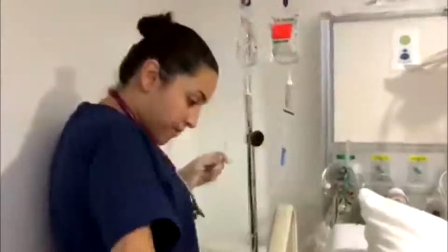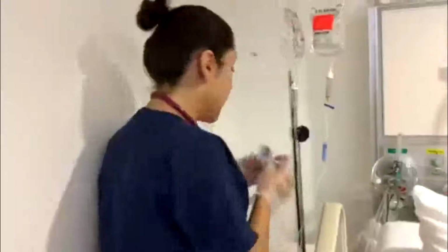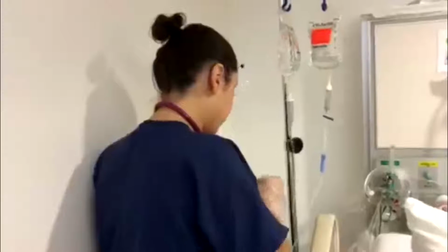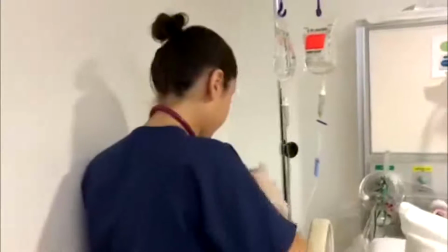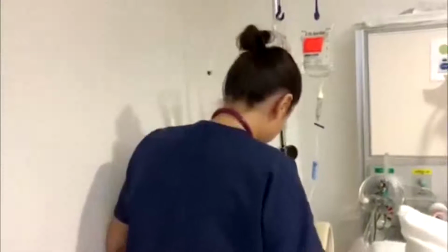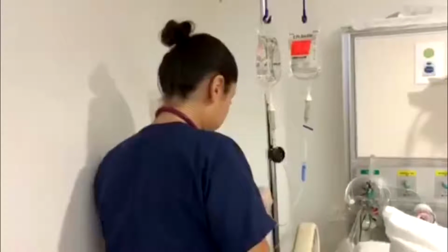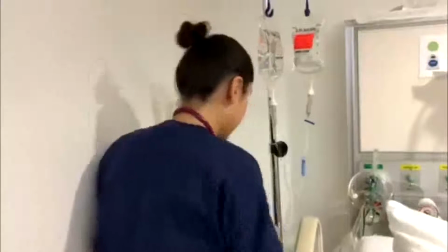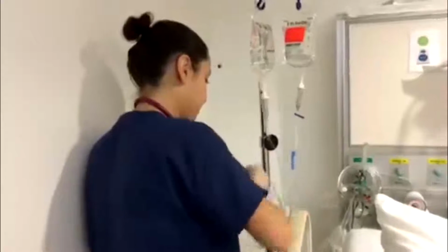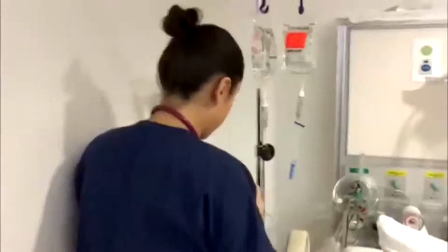Okay, so at this point, I want to maintain sterile technique and make sure to sanitize the site for at least 30 seconds before I connect it to the port, okay? And it's very important to maintain sterile technique while doing this. So for at least 30 seconds, clean it really well. So then I'll just attach both.